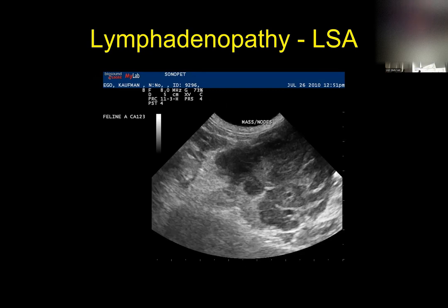That's going to be something much more sinister, like cancer, like lymphadenopathy that's caused by lymphosarcoma, other types of tumors, malignant histiocytosis, metastatic disease from something else that has now moved into or metastasized to that lymph node. So what you need to know about lymph nodes is slender, homogeneous, well-defined cigar-shaped nodes typically represent reactive nodes, and don't worry about them.